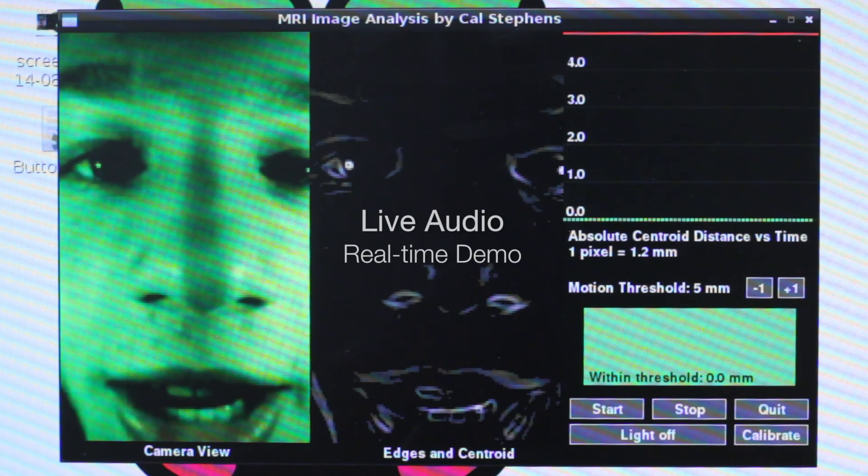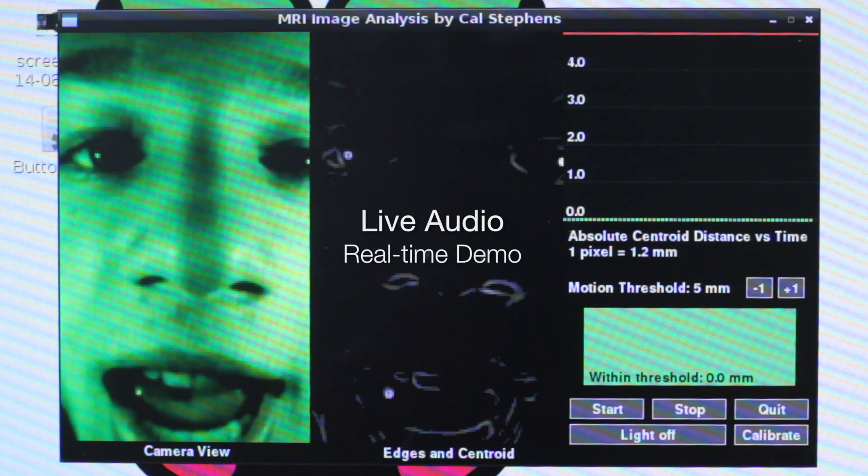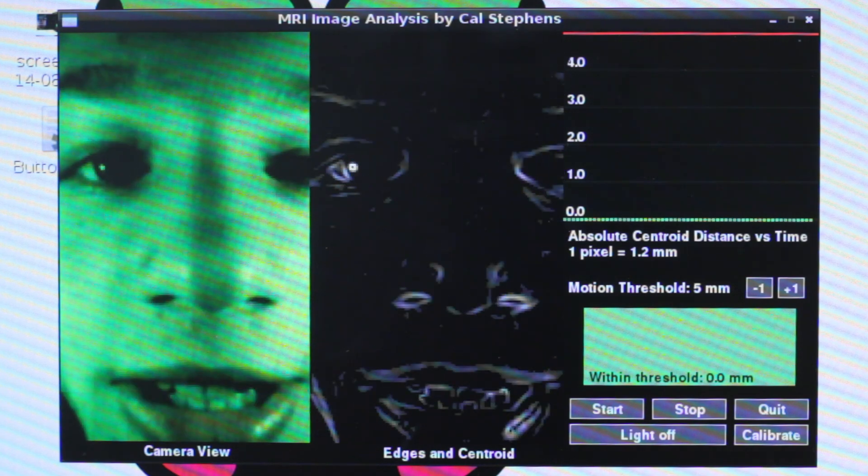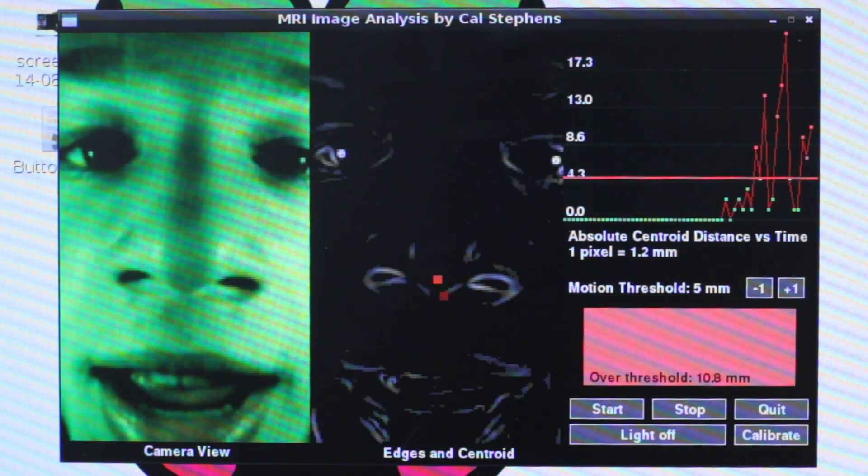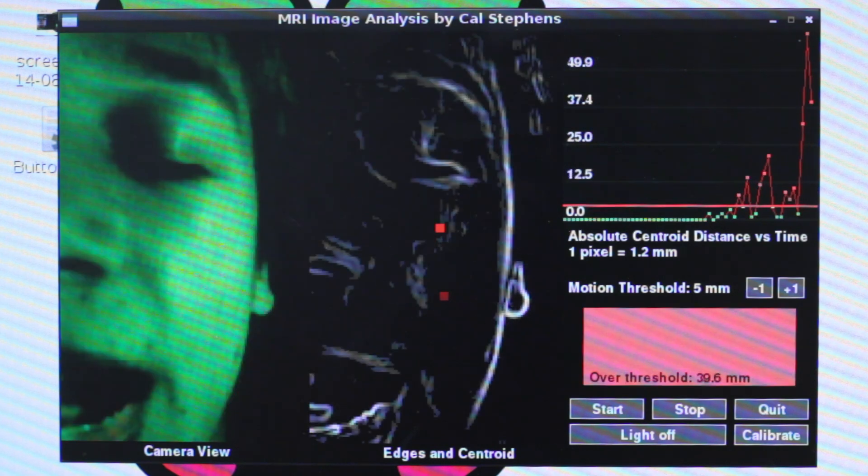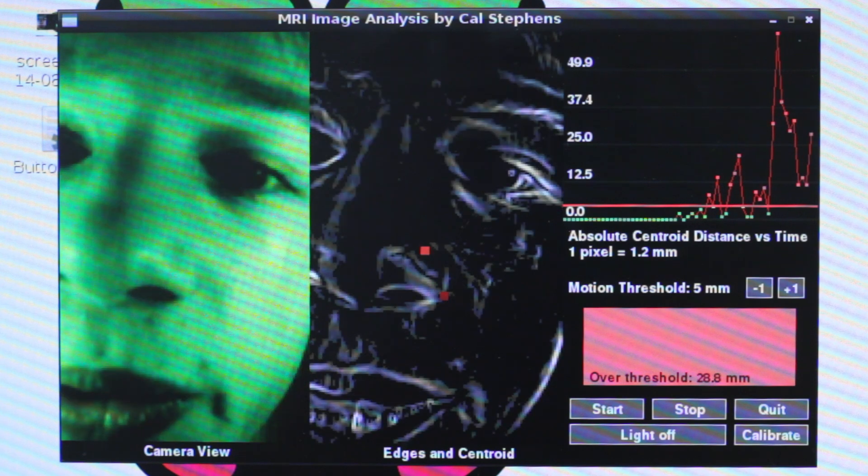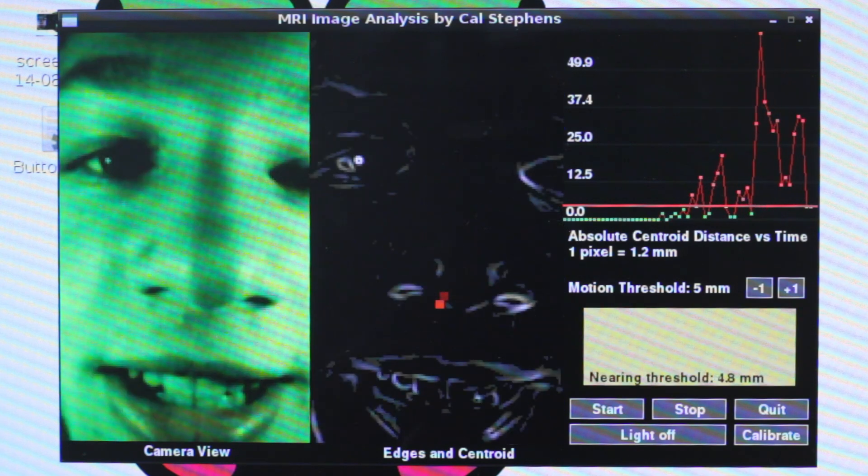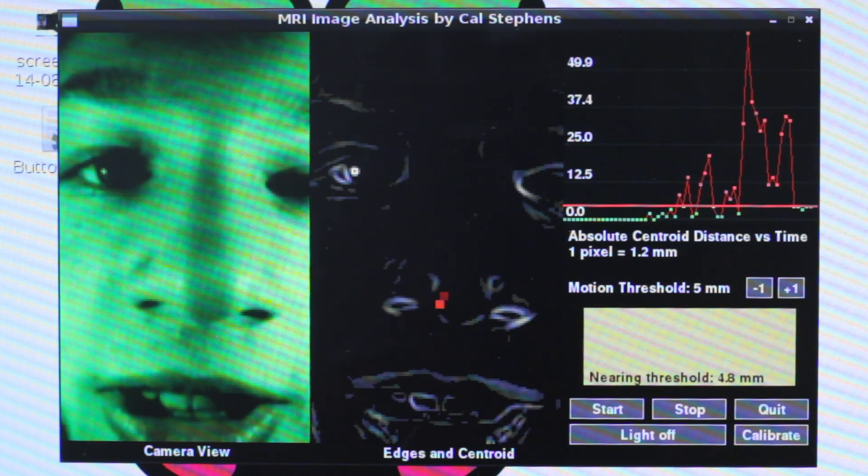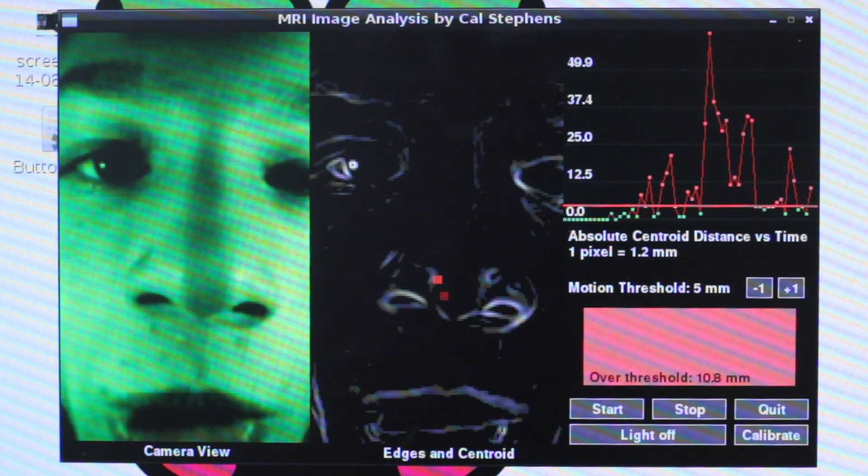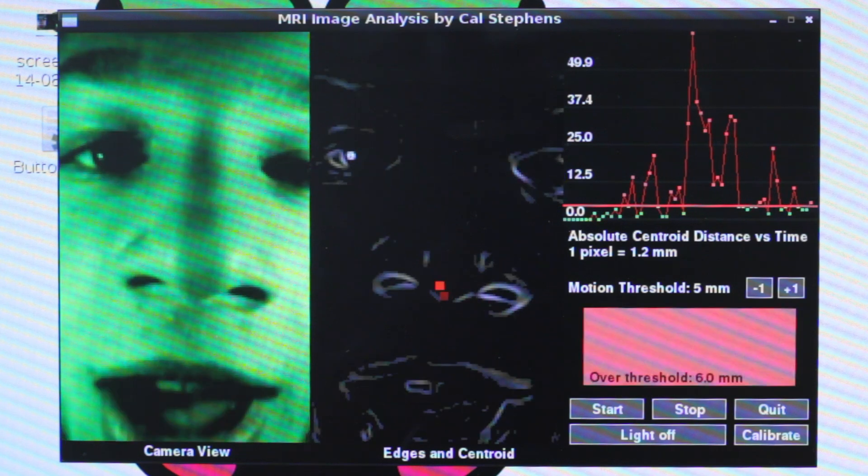The child's image is on the left side of the screen and the edges of their image is in the center. We use those edges to track the motion of their face around the frame. As you can see, as I move my head around the edges move and the red dot in the center moves with them. We use that center dot to graph their motion. We have it related to millimeters right now. One pixel of the image is correlated to 1.2 millimeters of actual distance.